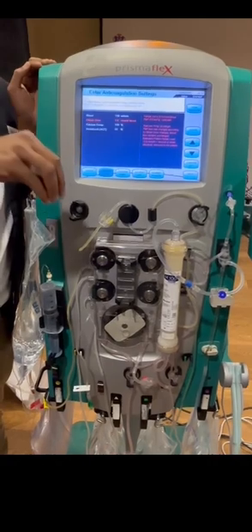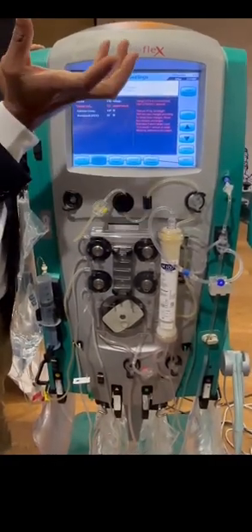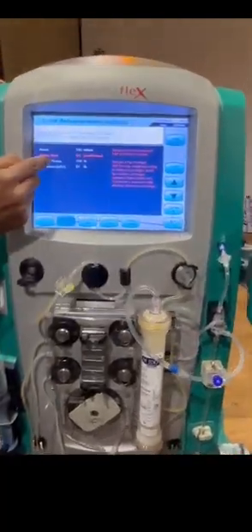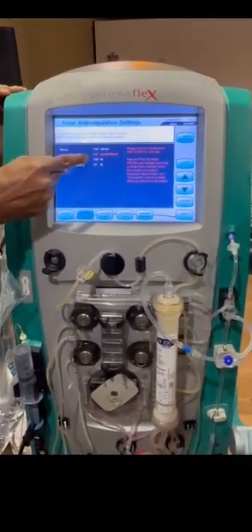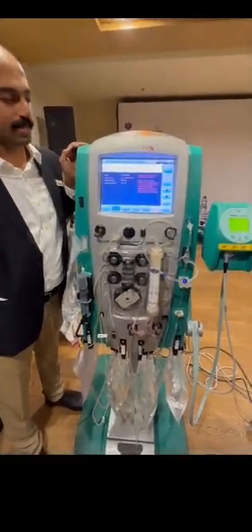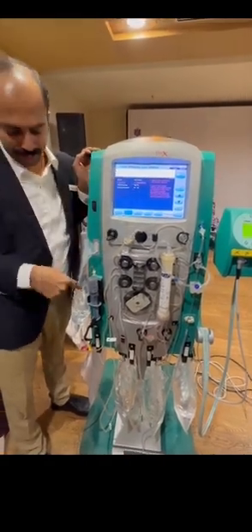If it is less than 0.25, we have to decrease the citrate dose. If it is more than 0.5, we have to increase the citrate dose. I'm confirming that, and this is the calcium compensation. Okay, that is 100%. If the patient's ionized calcium is still less, not in the filter, we can make this 100 to 105 or 110. Okay, that is delivering from here.